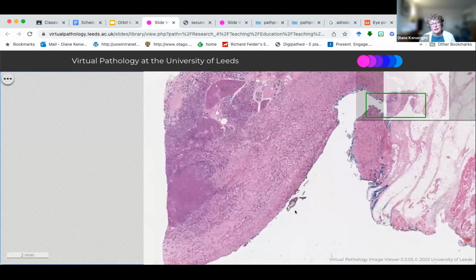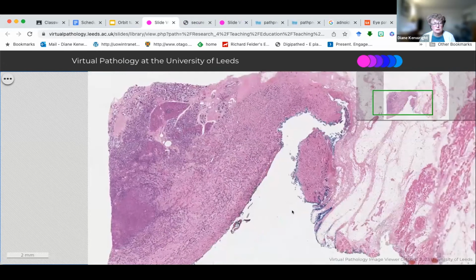So where is the normal tissue? Oh, normal tissue is here. This is the eyelid, or the skin. Probably the eyelid because here's the orbicularis muscle. And then here we've got the remnants of the normal lacrimal gland. And then beside it, we've got blue stuff. So here we don't have that stellate myxoid stroma. We've got cells that are pretty uniform looking.